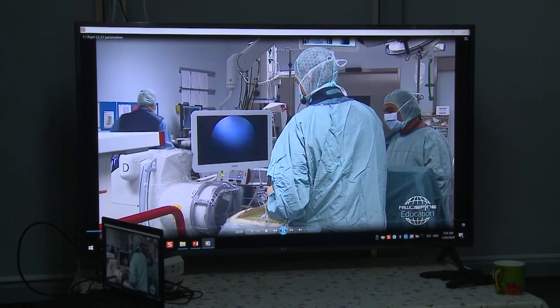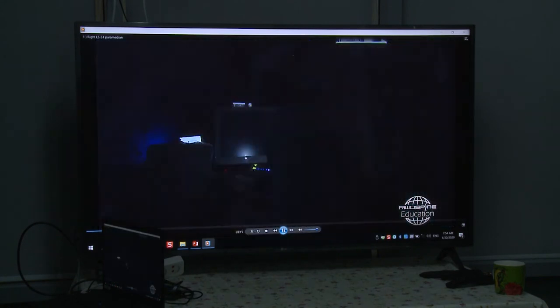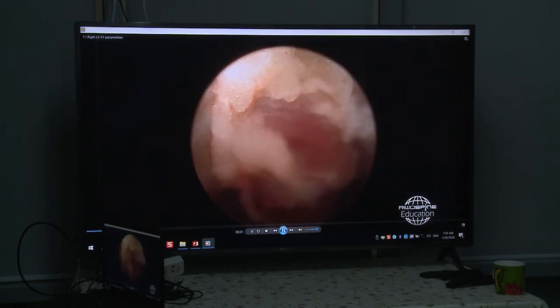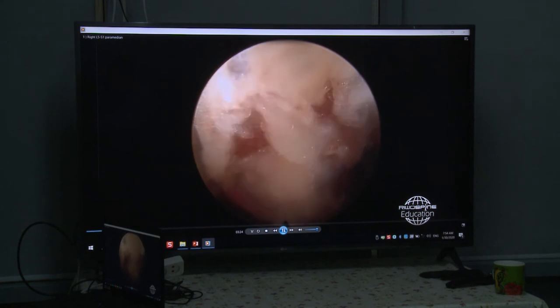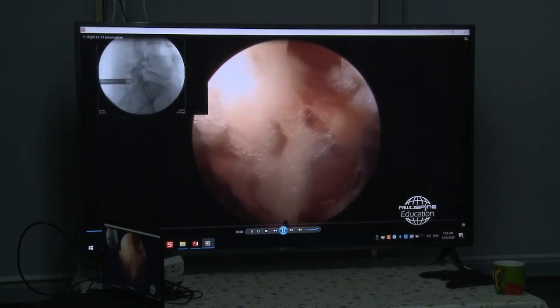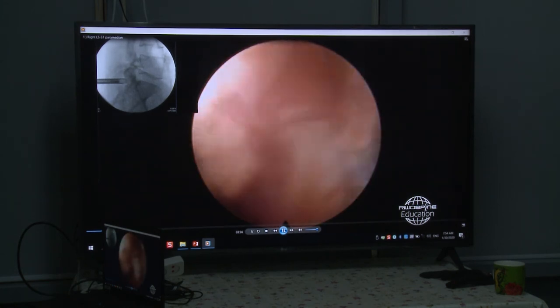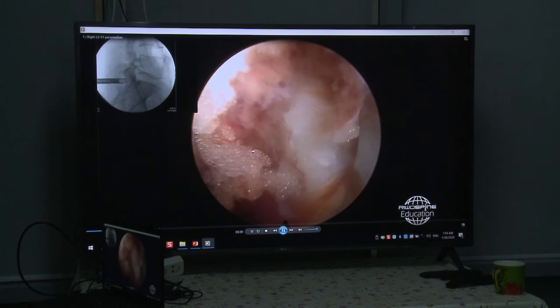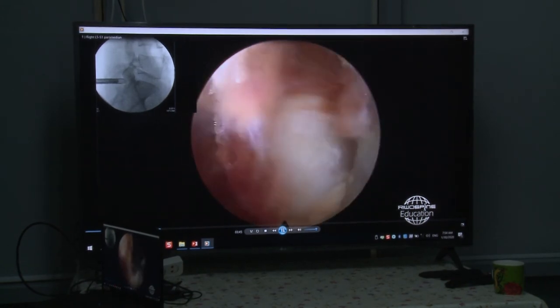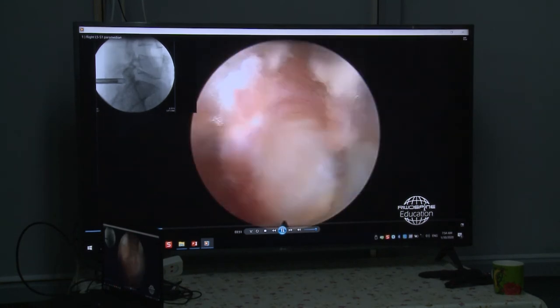And we switch to the endoscope. Muscles in front of you. Now we need to find the flavum. First, I try to prepare the flavum ligament in front of me. This white thing, what you are seeing there, is already the ligament. He's using the rongeur, very fast. I push the cannula all the time a little bit down to avoid soft tissue coming again in front of you.